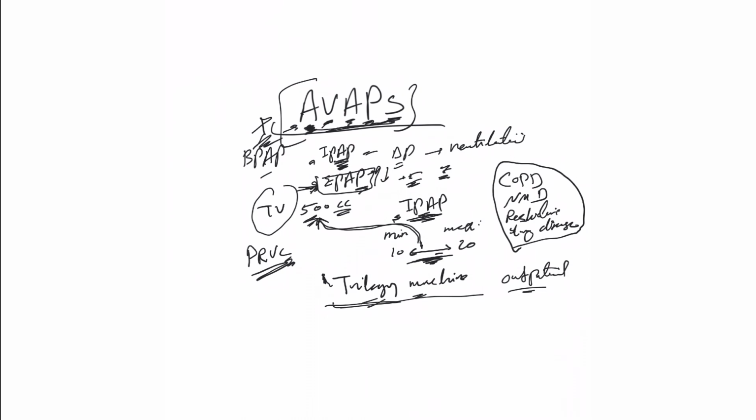Medicare is really strict about prescribing this machine because it's expensive, so you have to prove that the patient tried BiPAP at home and failed and is still chronically hypercapnic, so the tidal volume is not guaranteed. And I don't know the criteria for approval, but these patients can definitely and highly benefit from this mode of ventilation, if I can say.